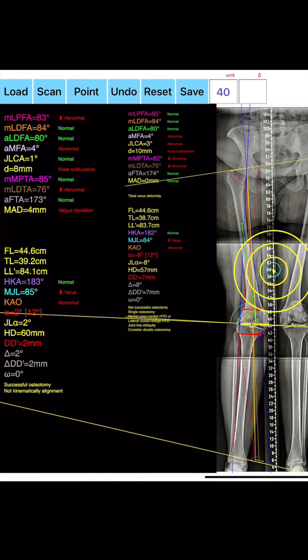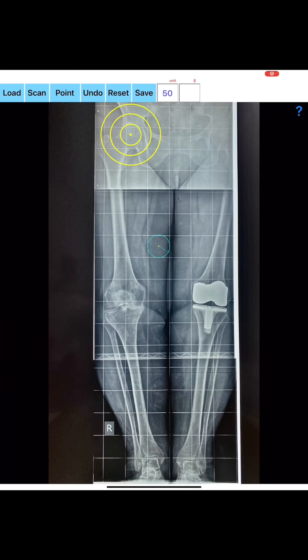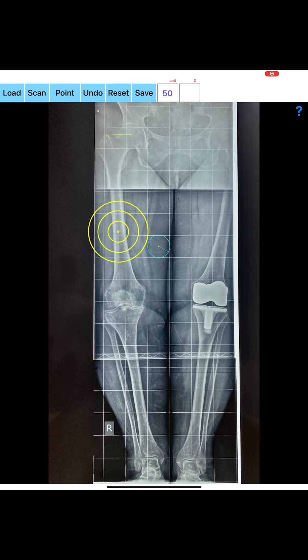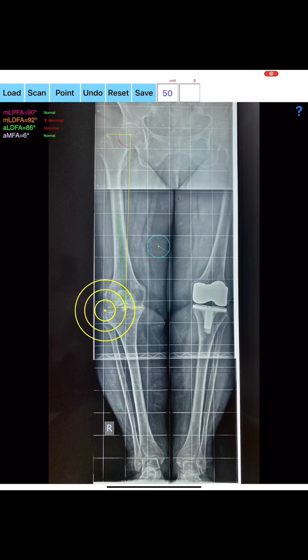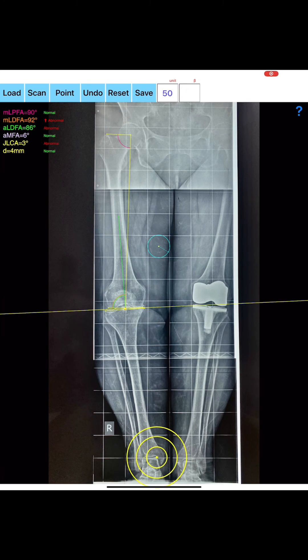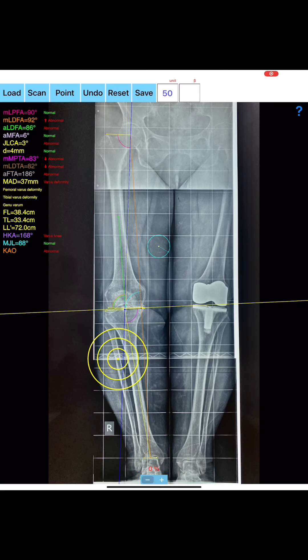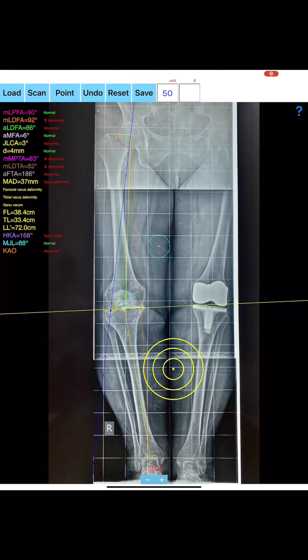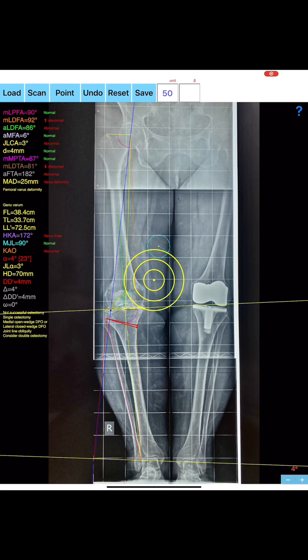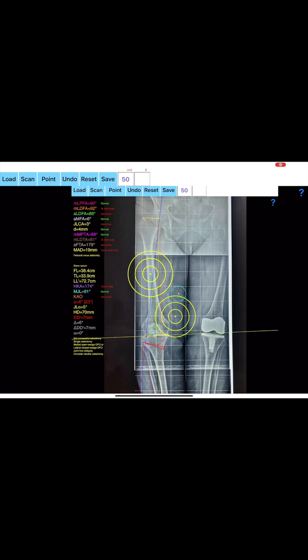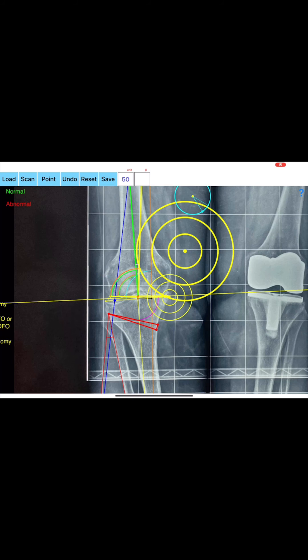Restoring the mechanical axis by osteotomies around the knee is easily calculated and presented on screen. In addition, by measuring the hip-knee-ankle line (HKA) and mid joint line (MJL) orientation, the app allows real-time evaluation of the success of the intended osteotomy by evaluating the kinematic alignment of the knee (KA), avoiding residual joint obliquity or malalignment.